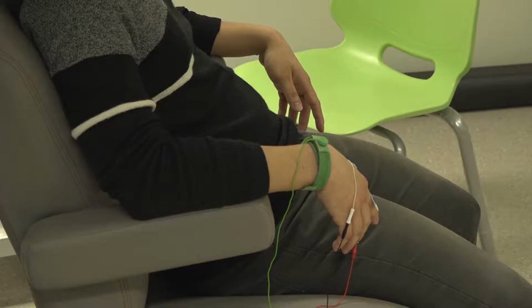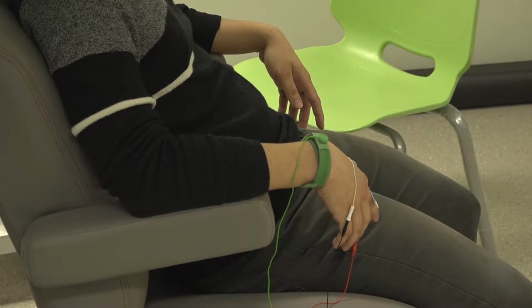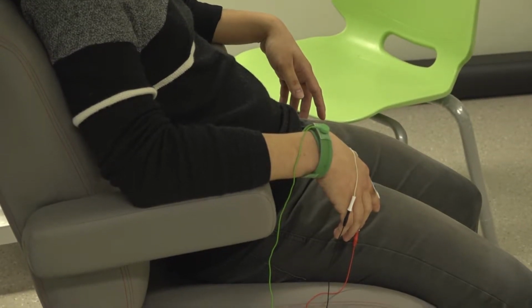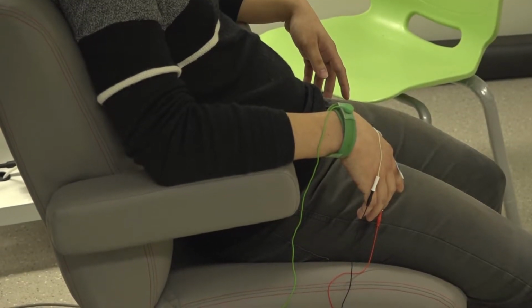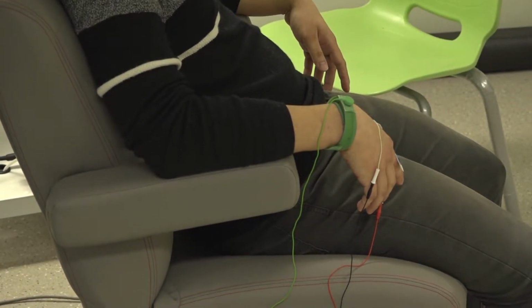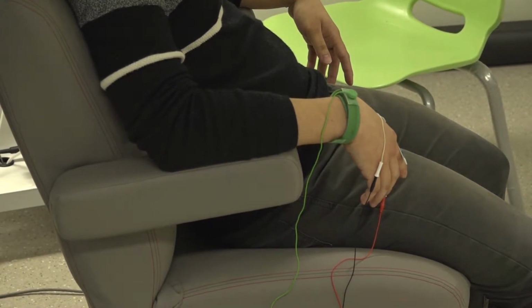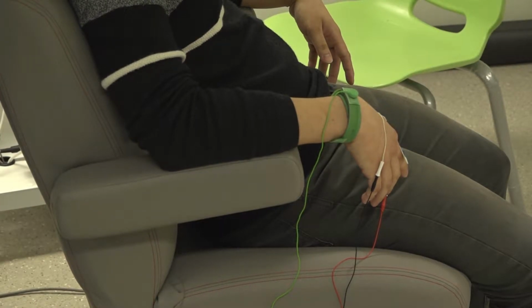Oh, you lost it. The coil is a little bit tilted, so try to put it straight. Very good, better. Yeah, very good. Excellent, excellent.